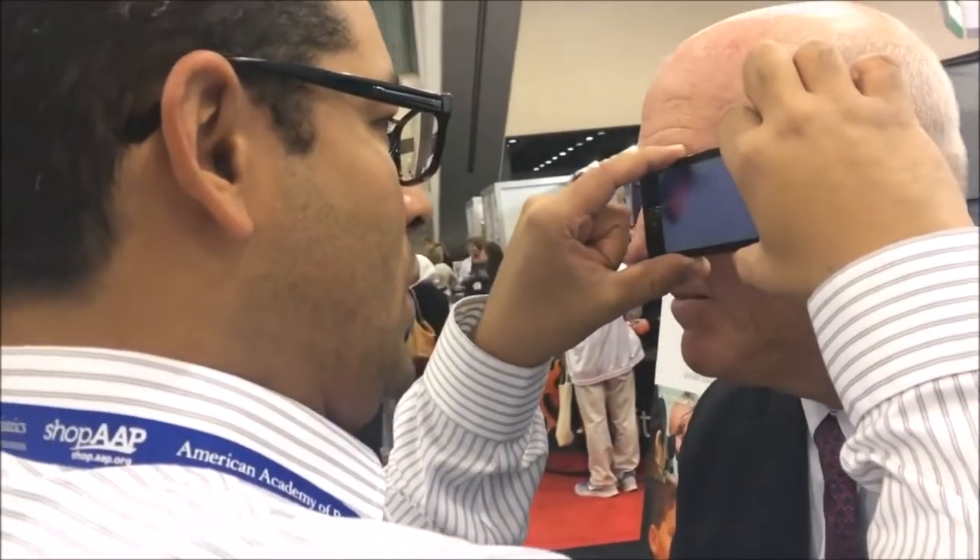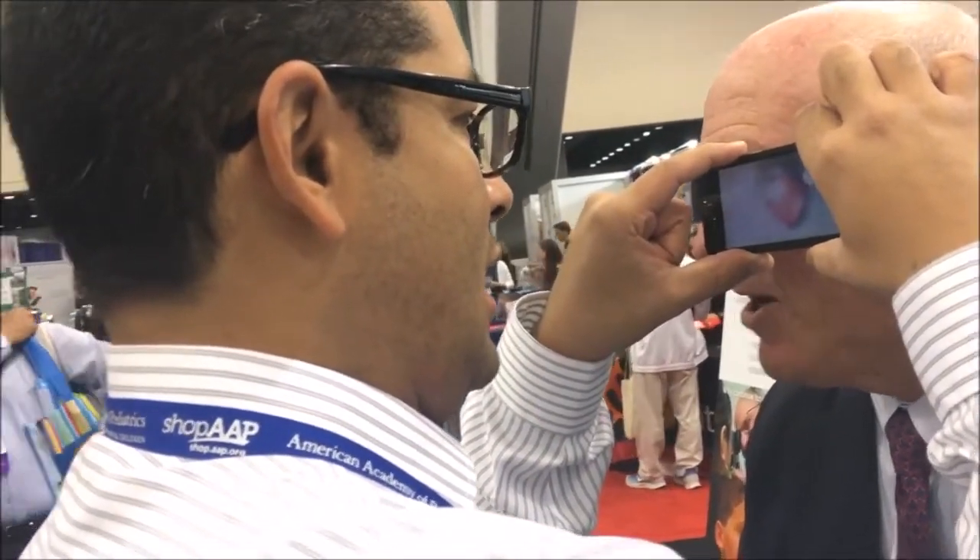Do you have my disc? Yeah. Now you can start following the vessels by tilting the phone. I'm not kidding. I'm just with this duplet. You're killing me. Thank you.